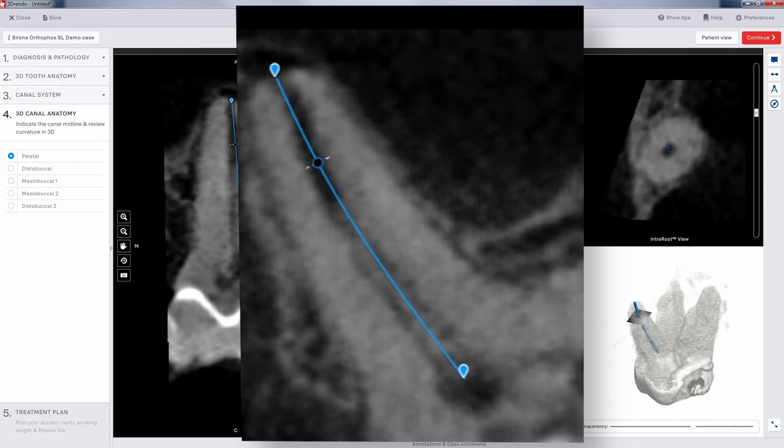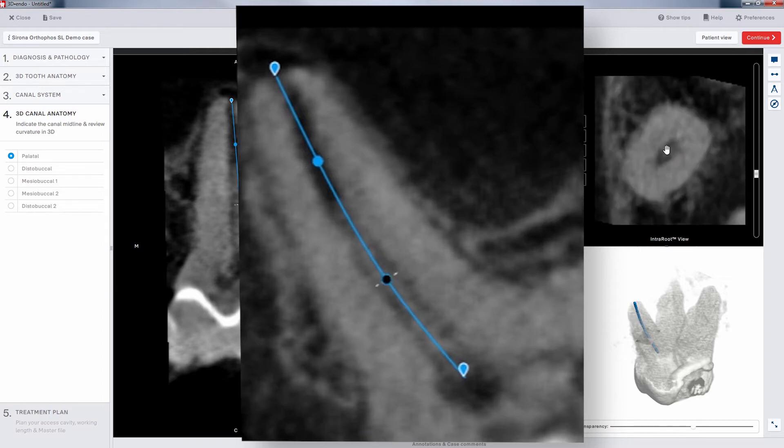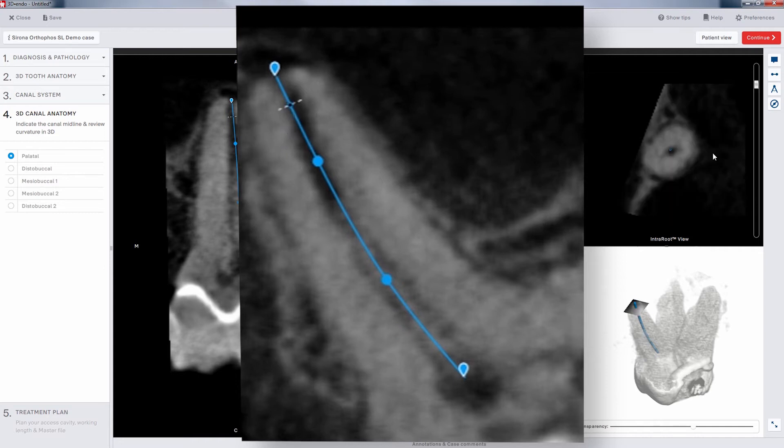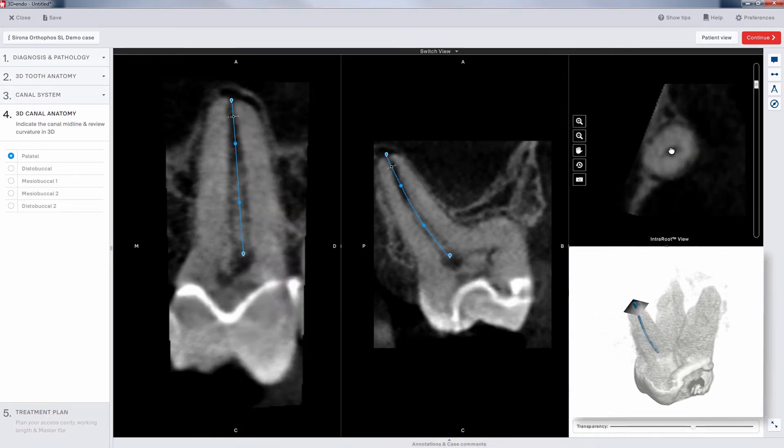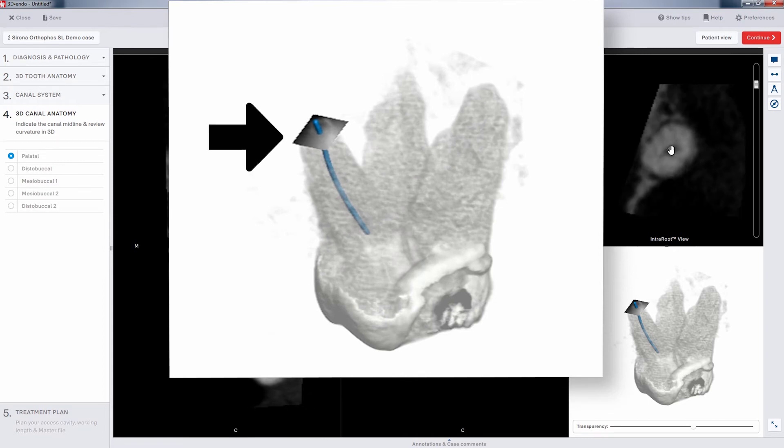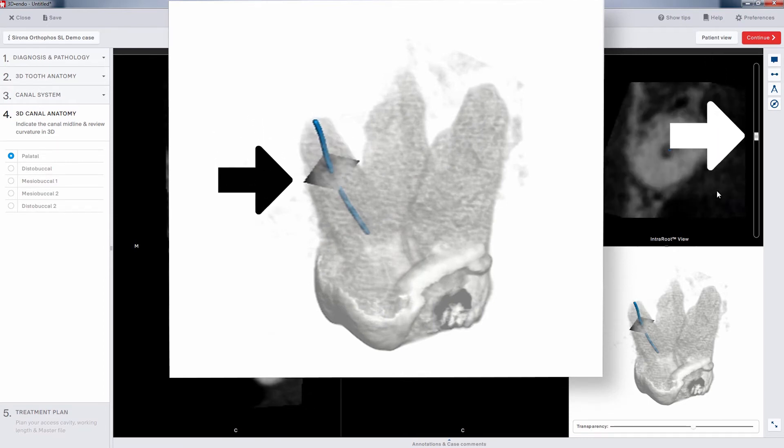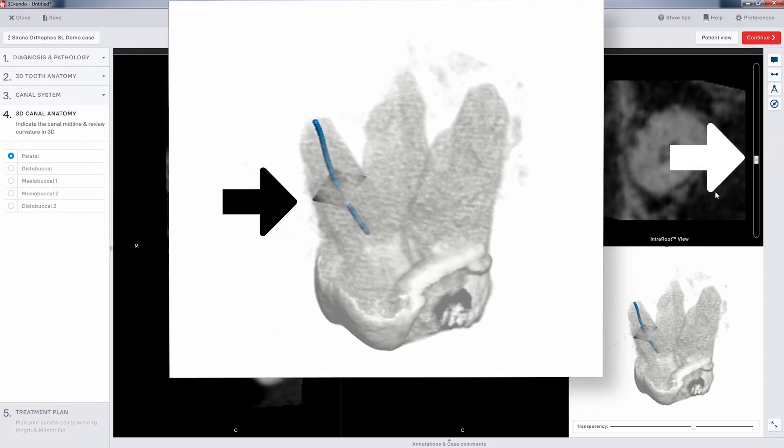You may want to do this a couple of times with a couple of different points on the canal. Re-center the line in each of the windows in this manner. The lower right-hand window shows a black square when you scroll through the slices, moving along the trajectory of the canal.